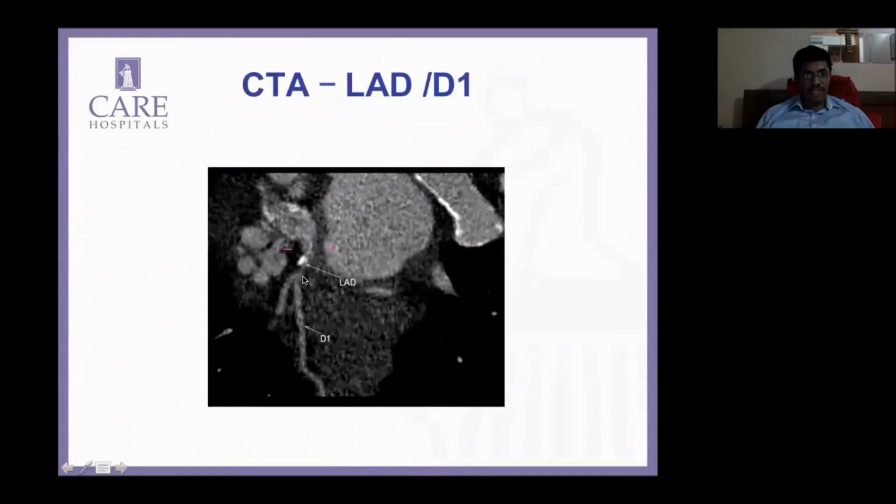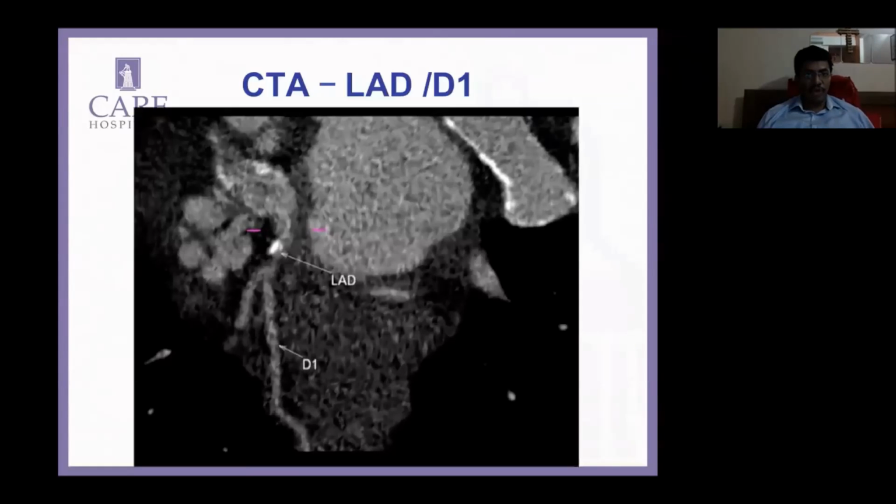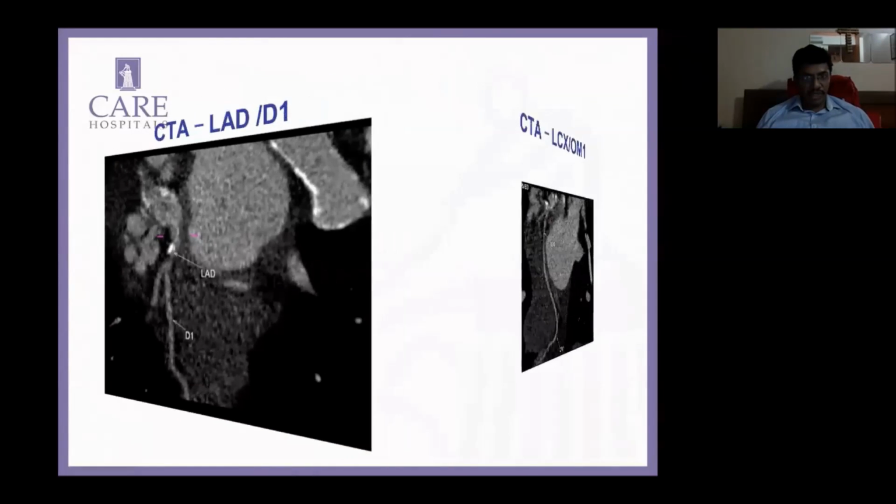And you can actually see the proximal LAD diameter really down. I think, Sharat, you already said that, just before a large diagonal coming off, with this block of calcium coming in from the left main. This is also just a blow up to give you an idea of the lesion.